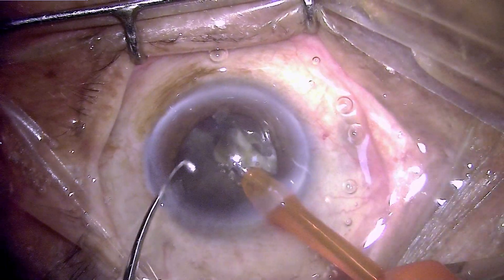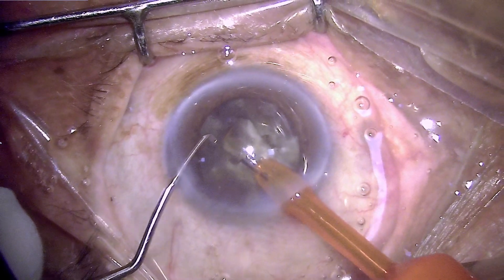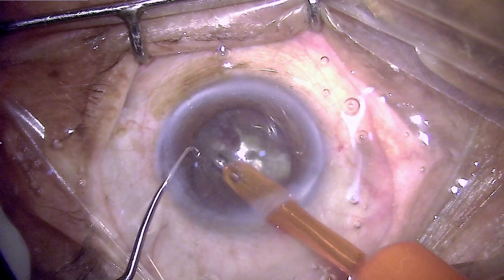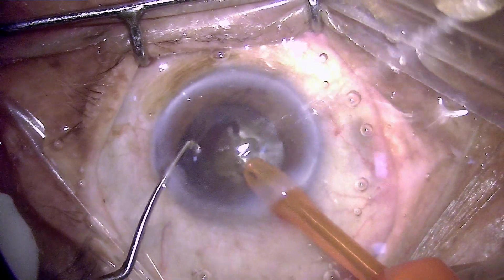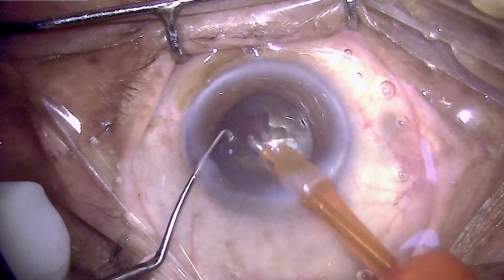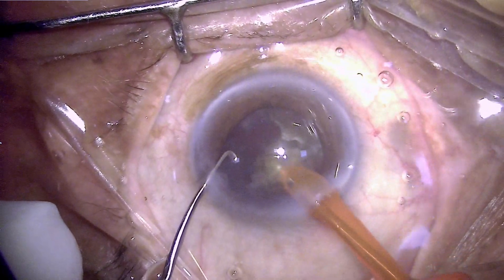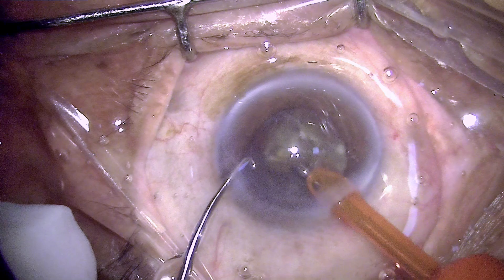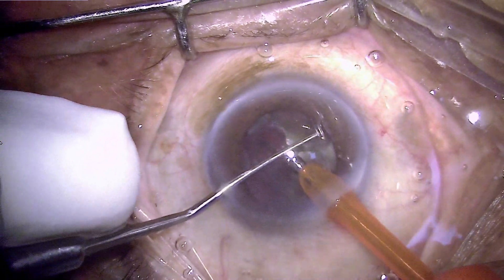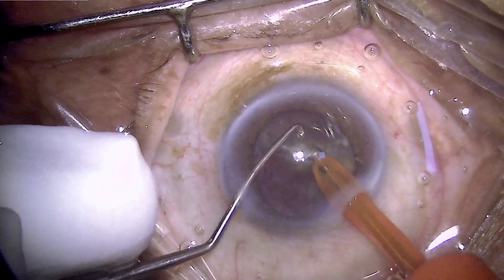In my experience, the only factor which causes endothelial cell damage is rubbing of the nuclear fragments over the endothelium, and this is due to two reasons. One is a shallow anterior chamber — I think a threshold can be defined as 2.8 millimeters; if any anterior chamber depth is less than 2.8 millimeters, SICS should be the preferred technique. Another issue is if you have adequate depth but still have a large, bulky, and hard nucleus — the way to handle it is cracking it into very, very small pieces or chunks.